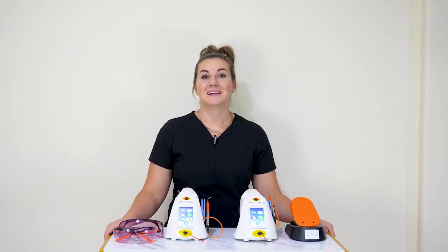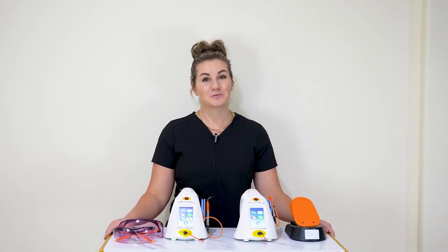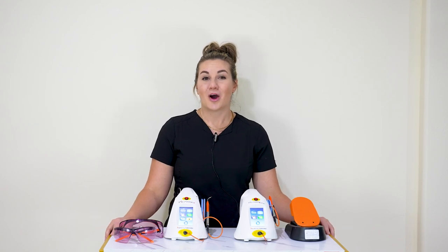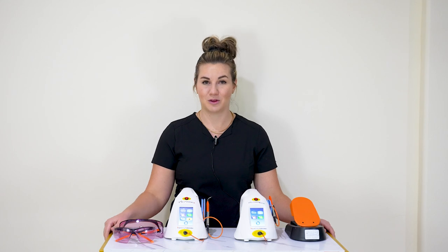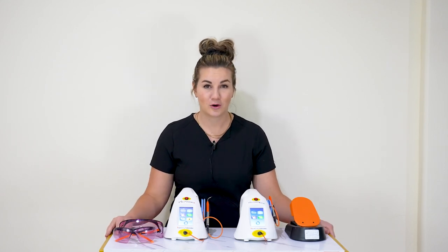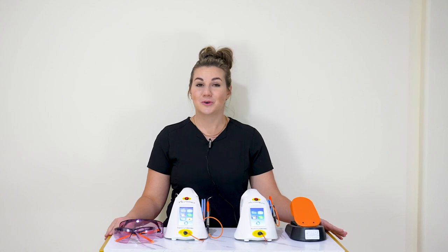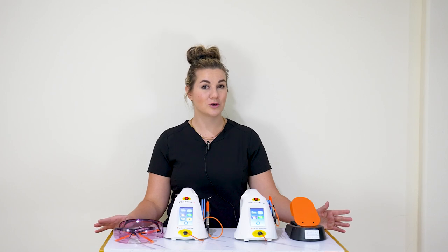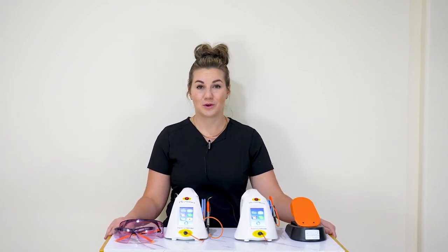The first thing I want to talk about is tips. In your box you probably got an assortment of colors of tips — there's probably some purple and some orange. The orange are a 400 micron and they come in a 5 and a 10 millimeter. The purple is a 300 micron that also comes in a 5 and a 10 millimeter. It is up to you and your practice what tip you want to use, and that's the tip that you would reorder.